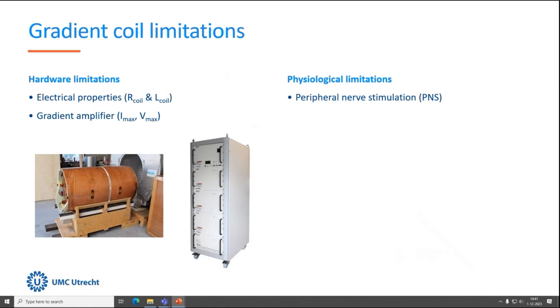Okay, so this is a little bit of an intro on what gradients do, why you would use them, and what effects they have on certain scans. Much more could be said, but a lot of topics are covered here. Phase velocity encoding, the Venks we talk about, all use gradients also to manipulate the contrast mechanism. And we'll talk about this here only on the readout part.